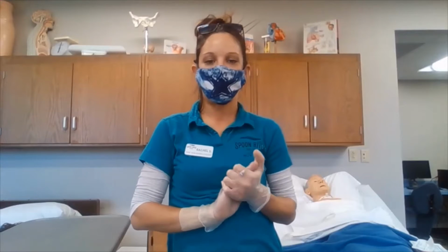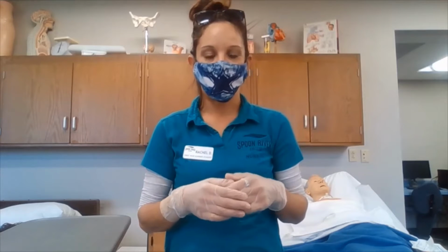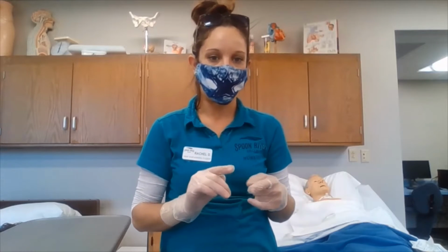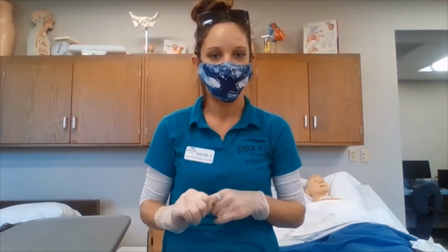For inserting a nasogastric or nasoenteric tube, we are going to be preparing the tubing first of all. If we are dealing with a plastic tubing, we are going to make sure to set it in a basin of warm water for 10 minutes. And if we are dealing with a rubber tubing, then we are going to be setting it in a basin of cold water for 10 minutes.